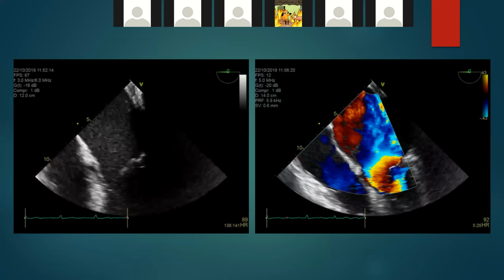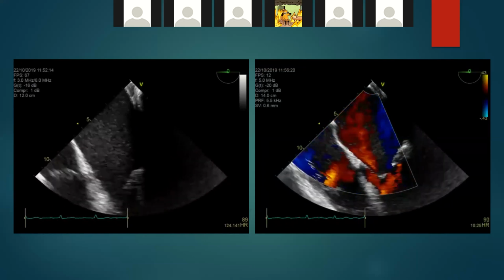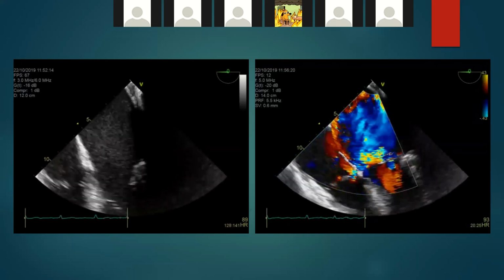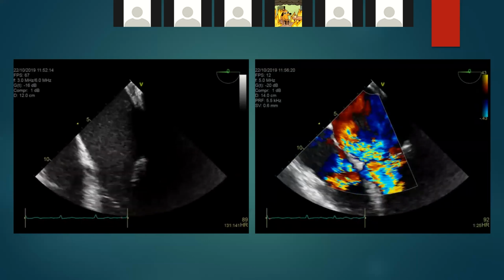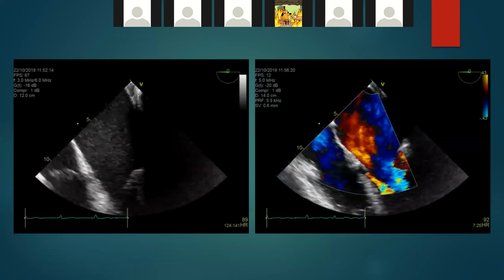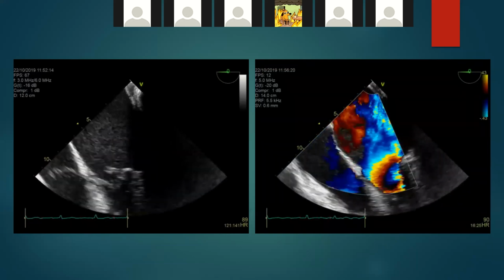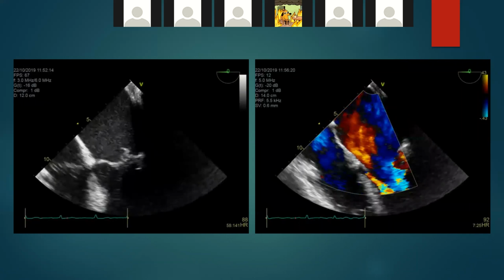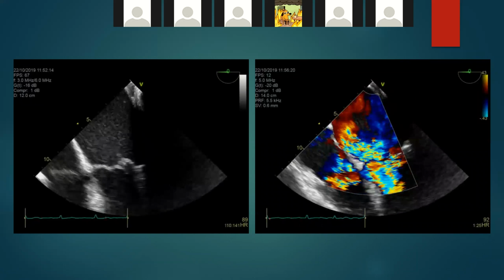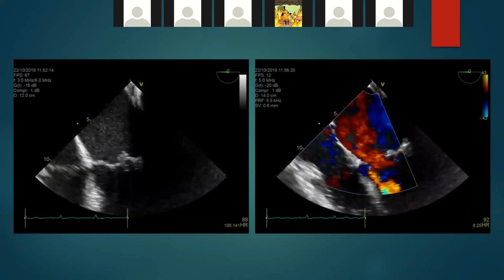Michelle, the mid-esophageal four-chamber, won't you have the same plane as the apical four-chamber? No. We are just concentrating on the mitral valve, because how you cut the mitral valve changes. It would be equivalent to the deep transgastric, the deep gastric short axis, but not the mid-esophageal. Yes, Daniel. It's the same patient, so a few more views.